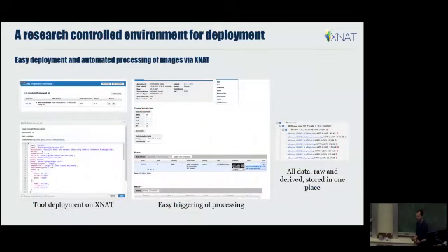And then on the system, we are able to containerize processing and have automated deployment of it. On the left-hand side, you don't have to read it, but we will have a container style of environment which we are able to deploy, and then put some rules. As soon as a T1-weighted MR of the brain arrives, I'm going to trigger a container, and it will parcellate the brain into 200 regions of interest that have got volumetric information, and everything will be in the same place: my original data, my derived data, and anything associated with it. And we also store clinical information within.